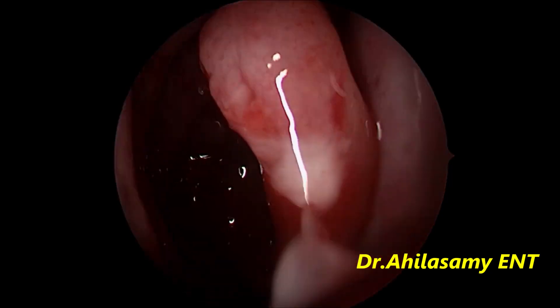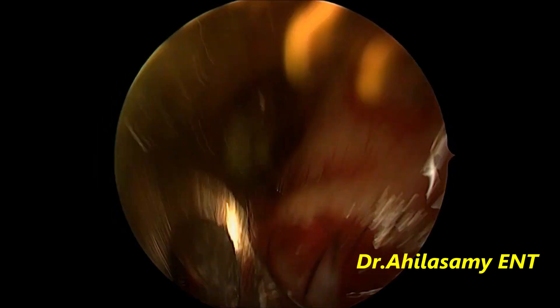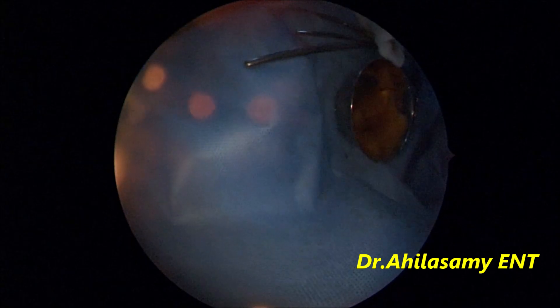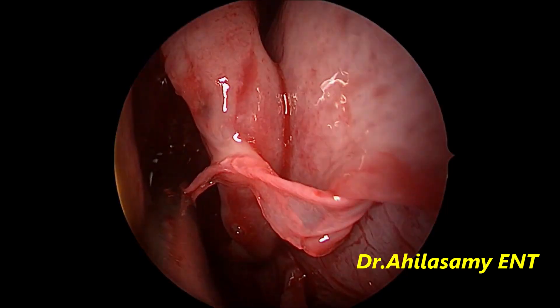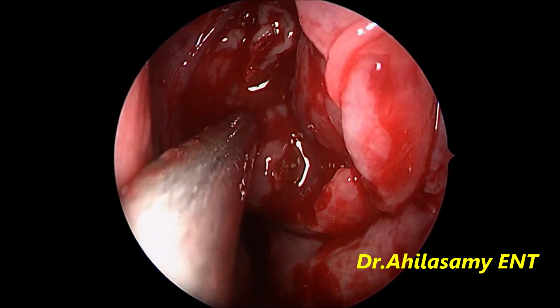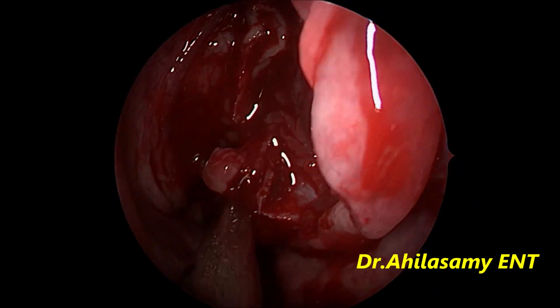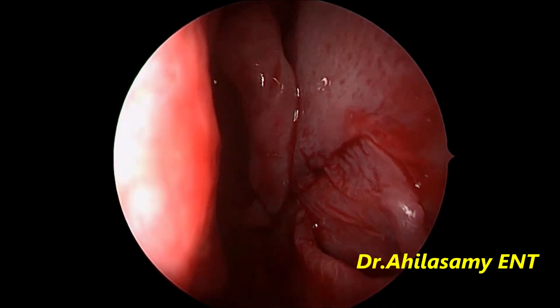Since I have shown many AFS videos, in this case I am not showing the full surgery or the septoplasty steps. Never destabilize the middle turbinate, otherwise it will stick to the lateral wall. This is the posterior part of the concha bullosa, which will be shaved with the debrider.